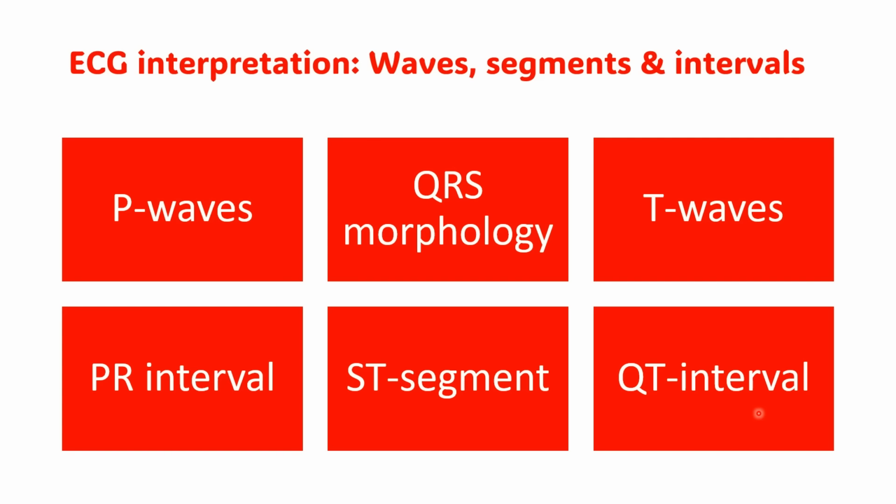So in terms of the introduction, that's everything that I'd like to cover today. I will be making separate videos on each of these in more detail. So P waves, the QRS complexes, T waves, PR interval. You get the gist. We're going to be going over these in more detail, and when we cover these in relation to specific disease processes, it'll really ingrain all of this detail in your head. Like I said, this is an introduction. We're going to be covering all of these little subtopics in more detail.